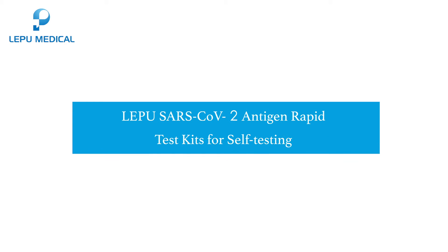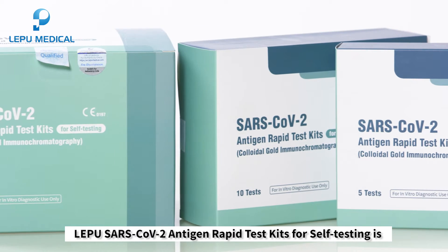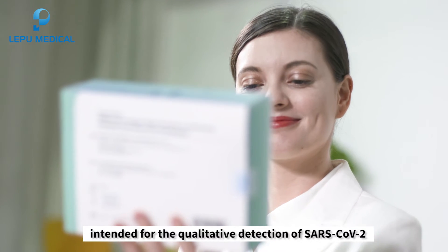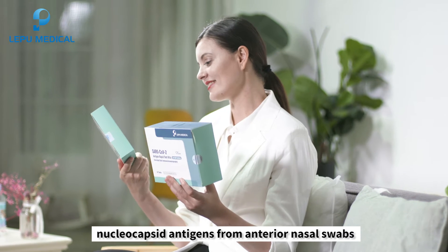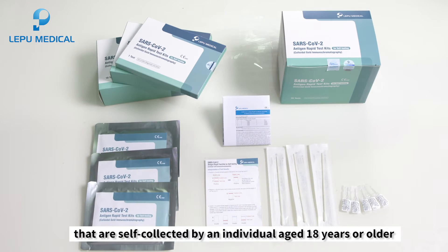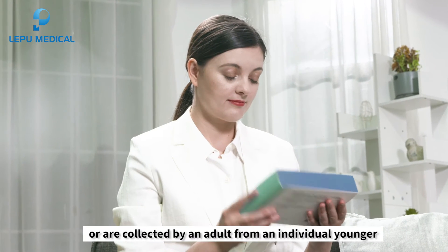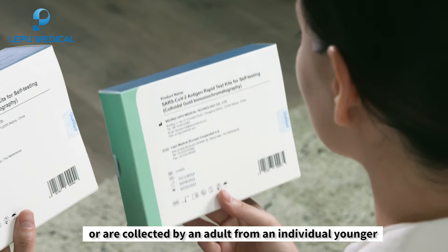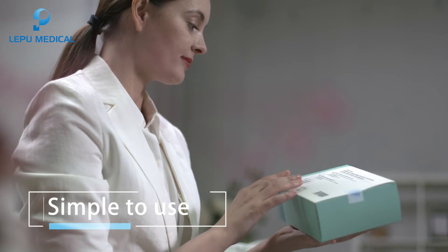Lepu SARS-CoV-2 Antigen Rapid Test Kits for Self-Testing is intended for the qualitative detection of SARS-CoV-2 nucleocapsid antigens from anterior nasal swabs that are self-collected by an individual aged 18 years or older, or collected by an adult from an individual younger than 18 years old.